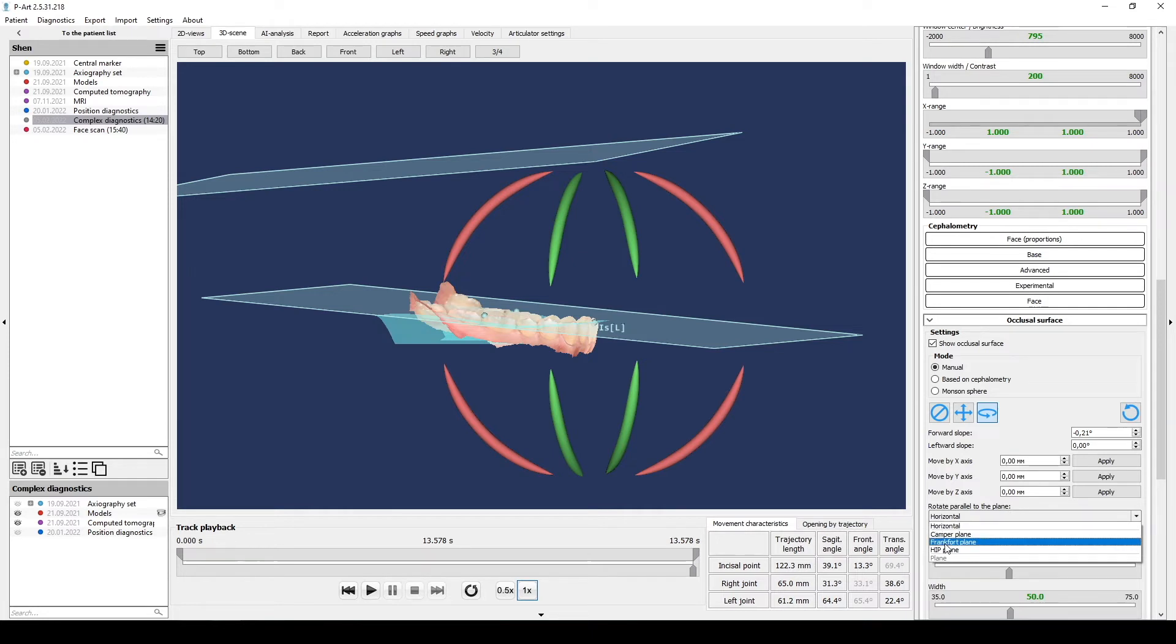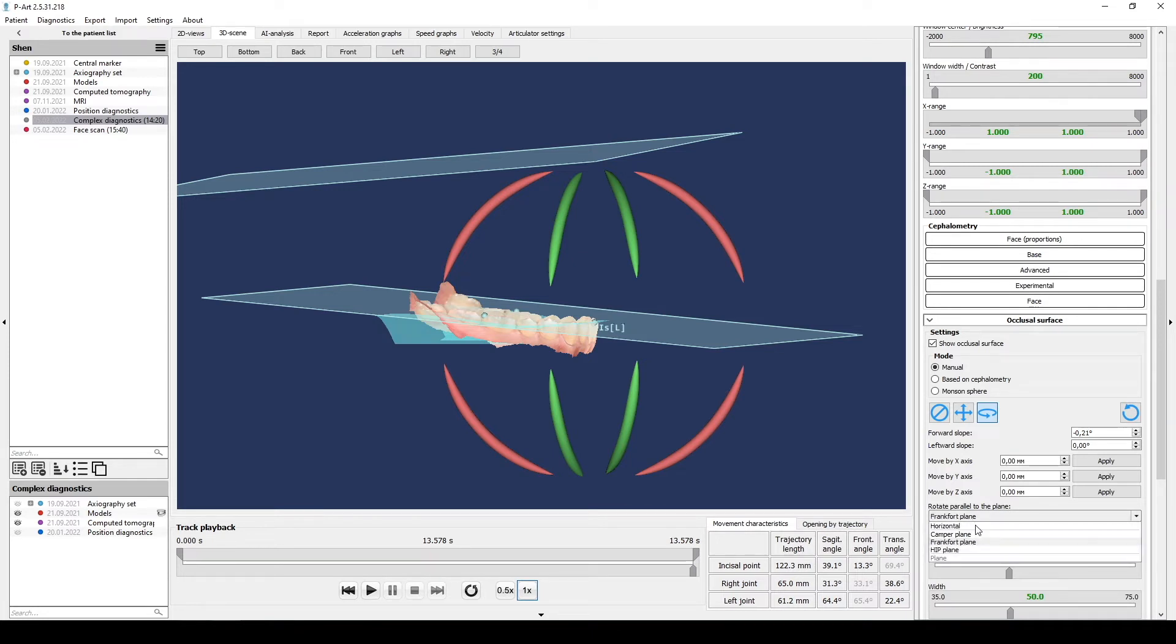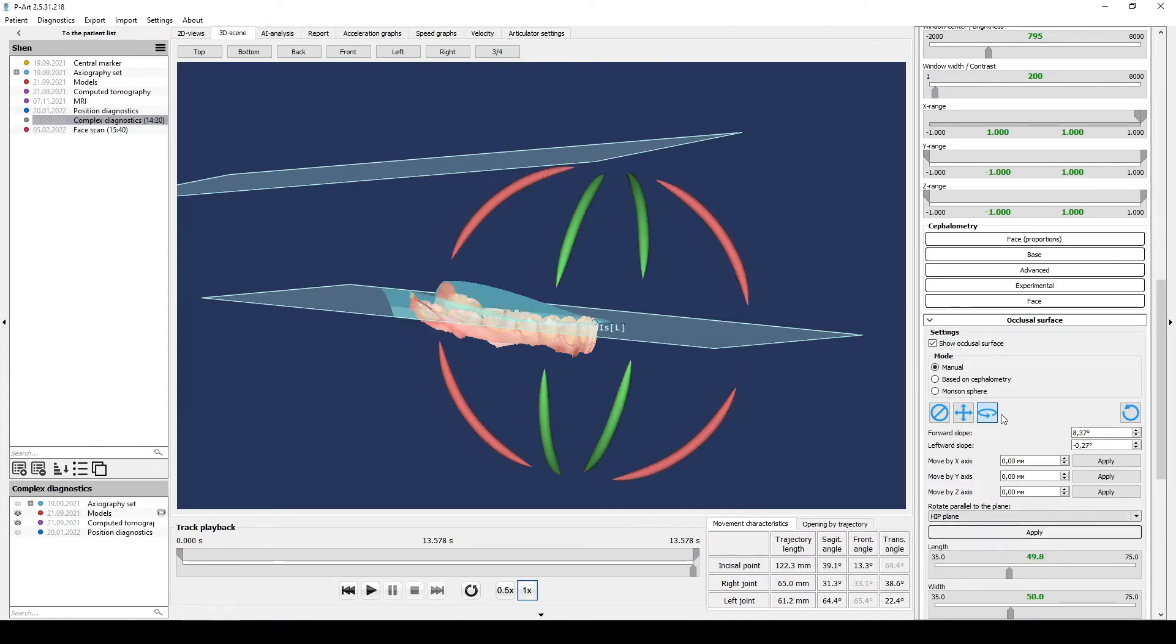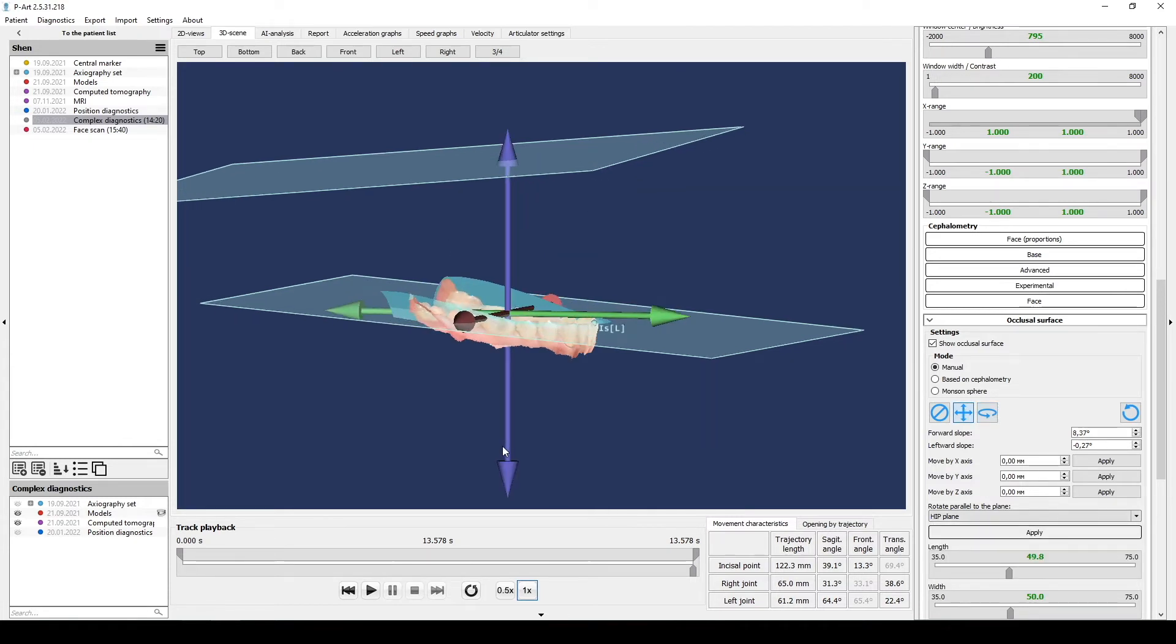we open rotate parallel to the plane and choose one. We can use manipulator to move or correct positioning in any direction.